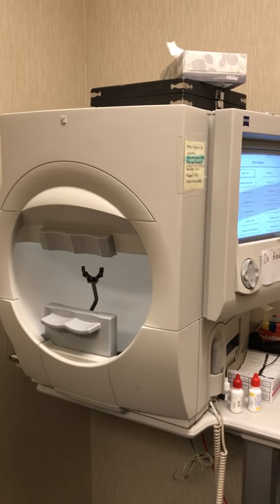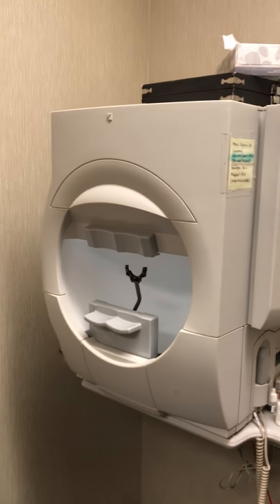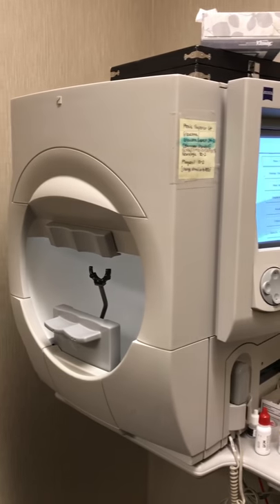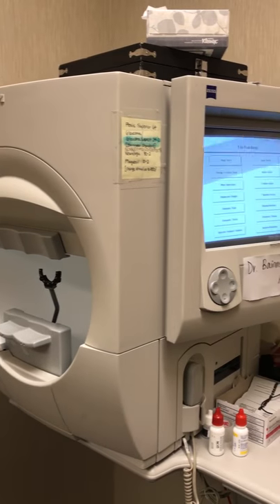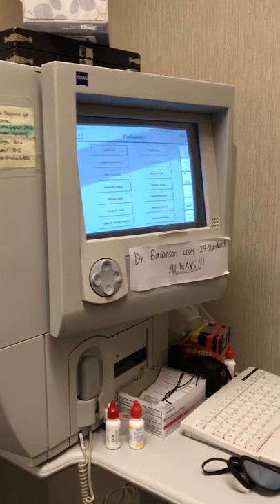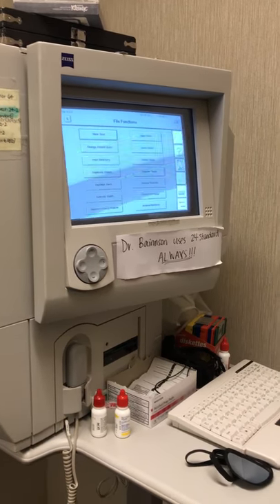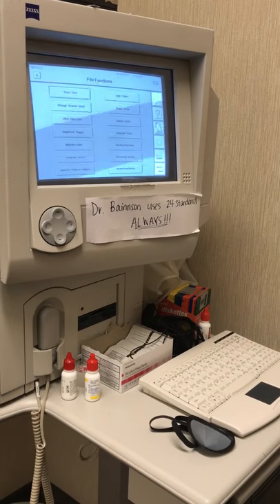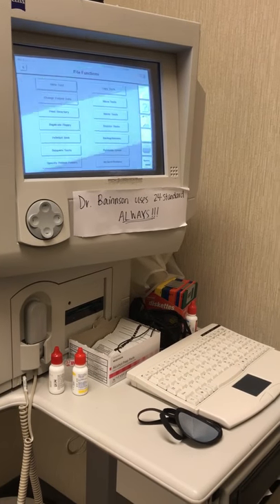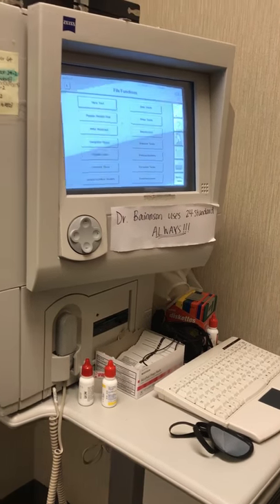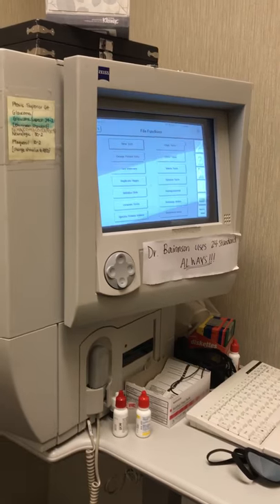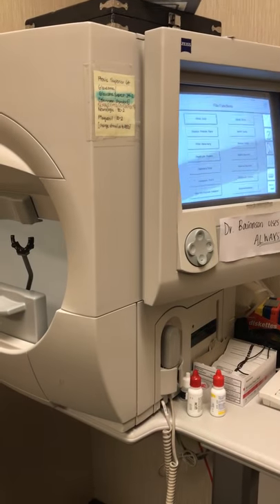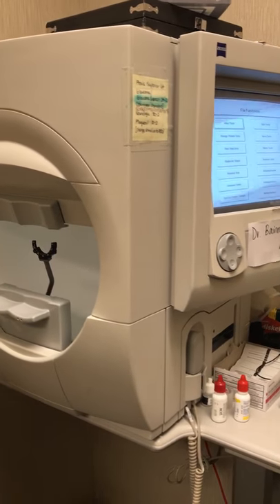This machine is the Zeiss Humphrey Visual Fields. There are different models, like the 740i and 750i. We mostly do this for glaucoma, but you can also do it for neurological reasons, if a patient has ptosis where the eyes or lids droop, or for people who are on Plaquenil.